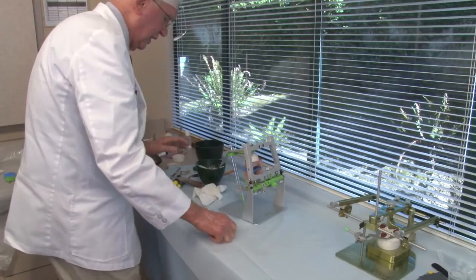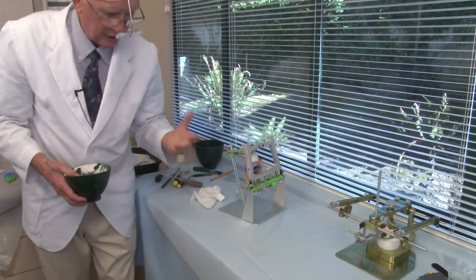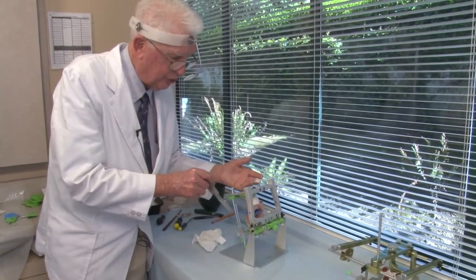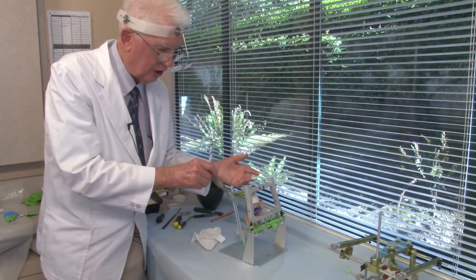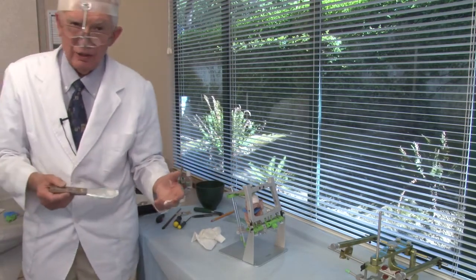I'm not going to try to add any more at this time. After the plaster is nice and hard, and I can take the models off and hold them in my hand, I'll add more plaster and make them very beautiful so that they can show good. If you start trying to add plaster now, what you quite frequently will do is you'll move the lower model. So you don't want to take a chance on moving the lower model just to make it look good. So just wait, and you can add the plaster later.